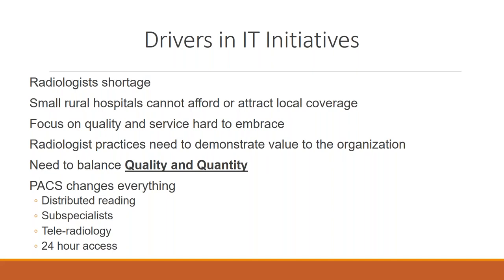Some of the drivers in IT and the initiatives: we're back into a radiologist shortage. A number of years ago, probably a couple of decades at this point, it was one of its worst points. And when PACS was emerging, it was really taking the ability to have doctors review and read images in areas where you could not hire. So a lot of change came from that radiologist shortage.